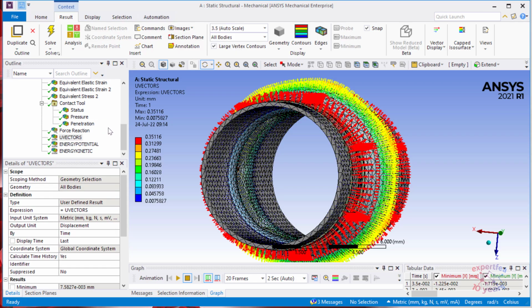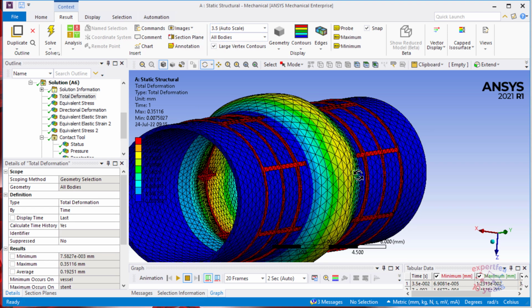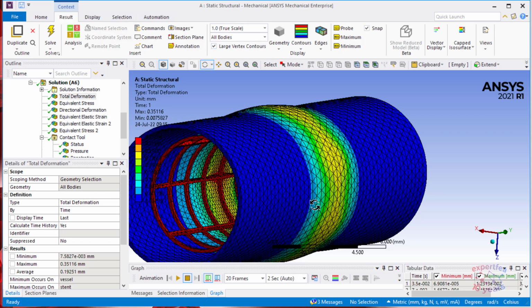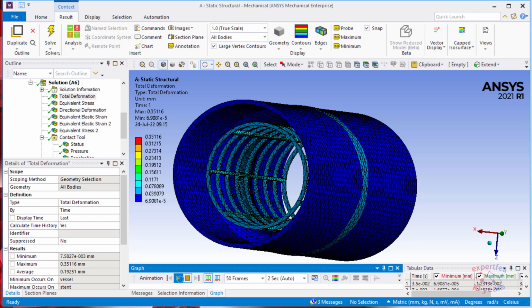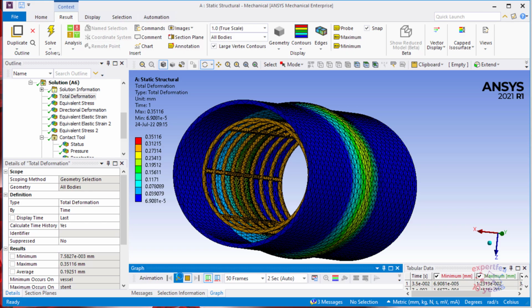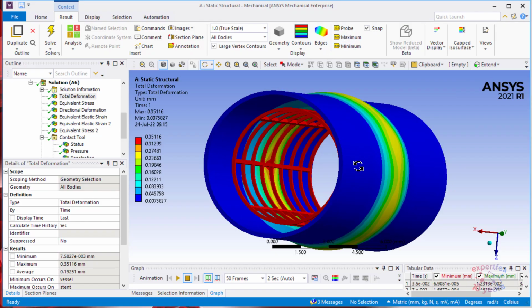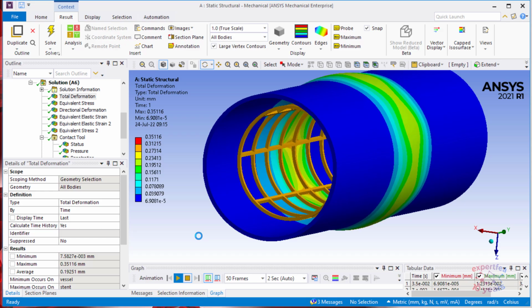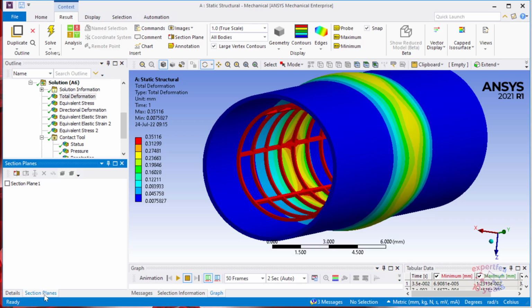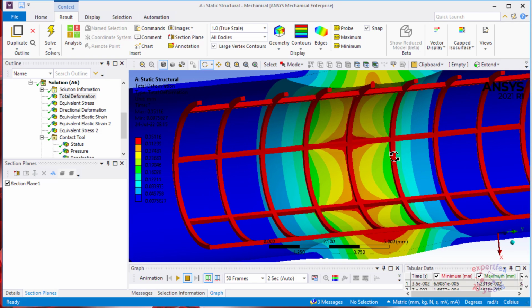Save. Let's look a little on the total deformation. Here the scale is not correct, so let's go to one scale. Let's animate a little, 50 frames. You can hide the edges of the mesh. Alright, and in the section view things will look much more correct and easy to understand.